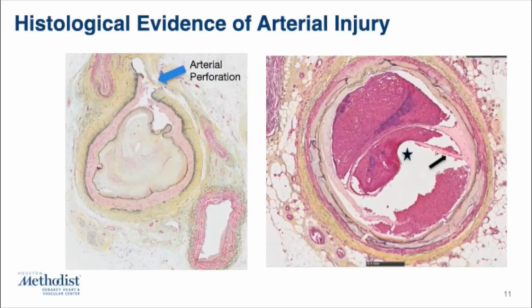The other advantage of using histological evaluation is you can see the amount of injury that you're causing. So on the, I have to think left and right here. On my right, your left, yeah, good thing I'm out of training. You can see a calcific total occlusion. And you can see that we've gone into a subintimal plane and then we've caused a perforation. This is a hard calcific lesion.